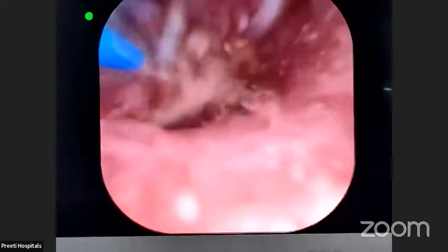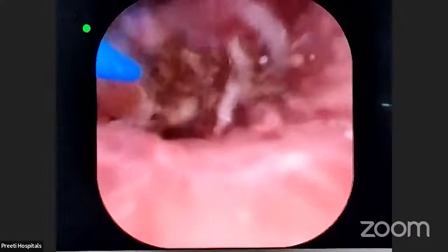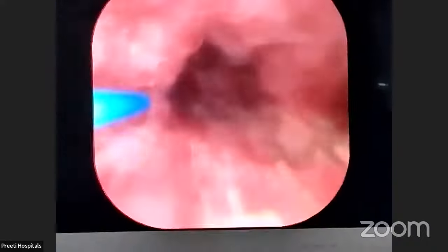Total time duration is how much? Scope time? 32 minutes operative time, 23 scope time, 11 minutes lasing time. Very good. Flush, flush, like this, you flush.